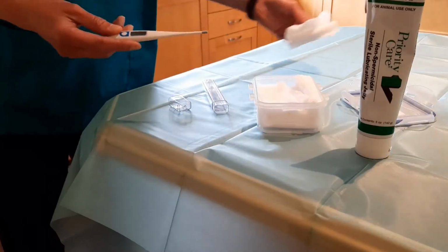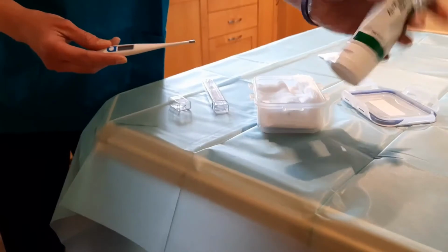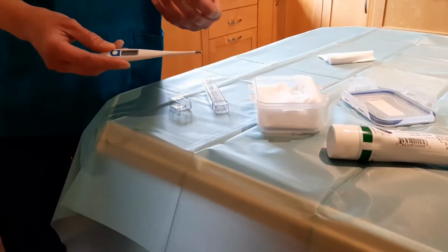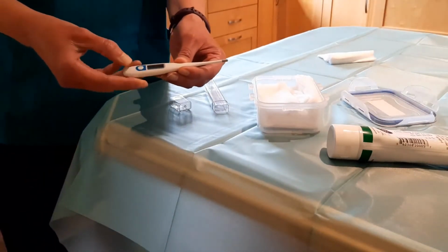This is an alcohol wipe. You'll also need some lubricant, and you just put a very small bleb of that on the tip of the thermometer, and that makes sure the patient is as comfortable as possible. Switch on the thermometer just as you insert it per rectum.